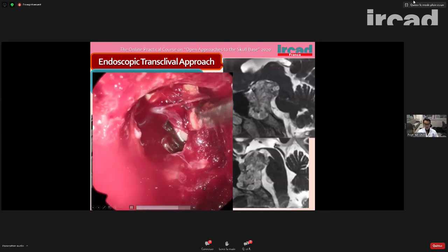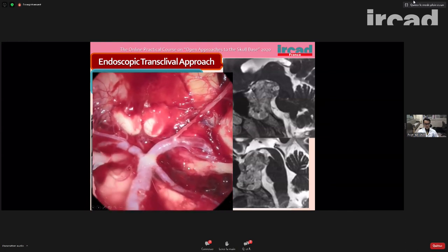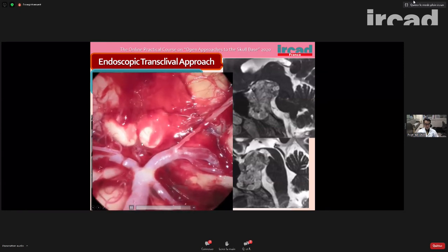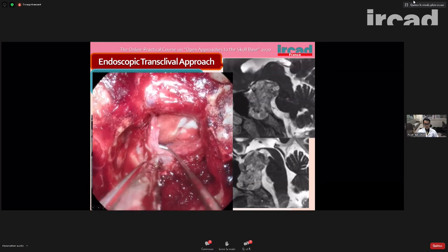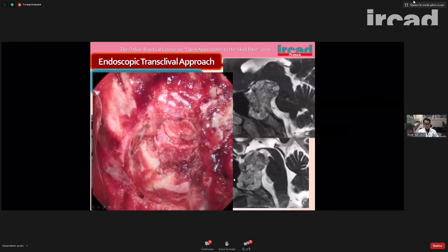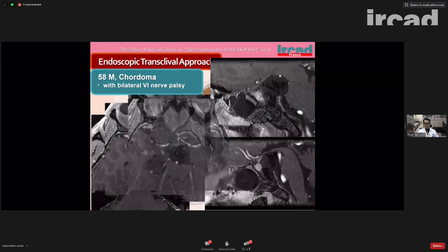And then there is a small residual tumor, so we remove it. And after that, we observe the mammillary body here, the basilar artery and PCA, posterior cerebral artery, and posterior communicating artery, bilateral, and oculomotor nerve here. Total removal was performed, and we made a reconstruction here. In this case, we achieved total resection, and his symptom also improved in 3 months.